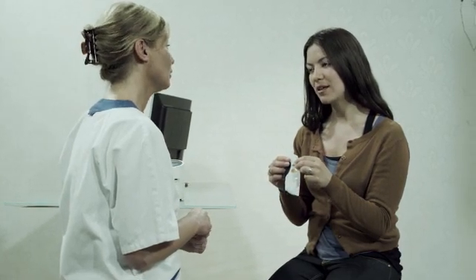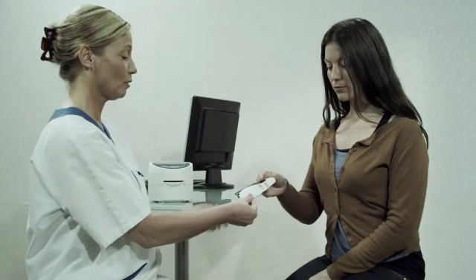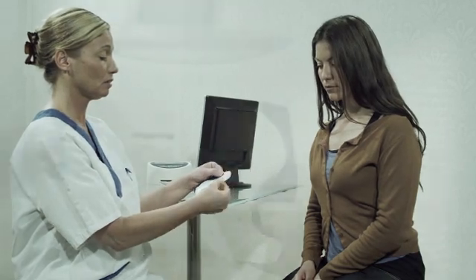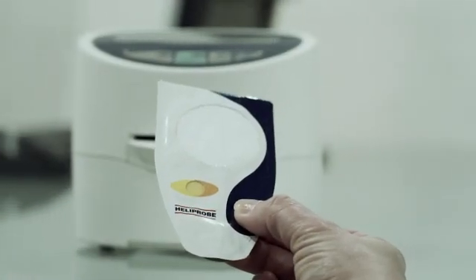Make sure the Heliprobe analyzer has been properly installed and is ready for use. Gently press the air out of the breath card without touching the transparent test zone. Make sure the transparent film is not broken.